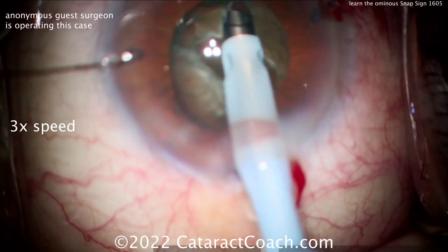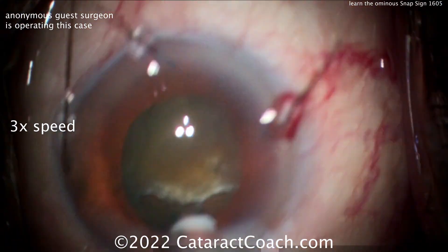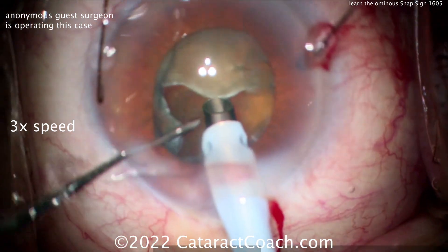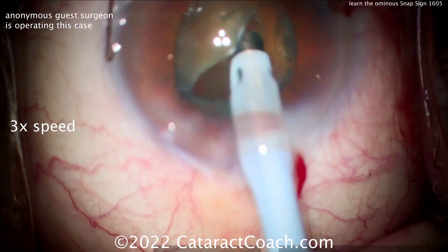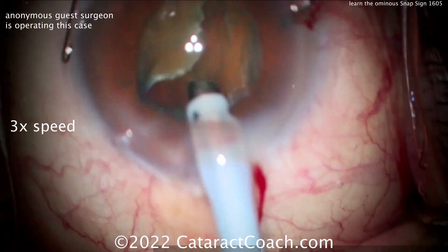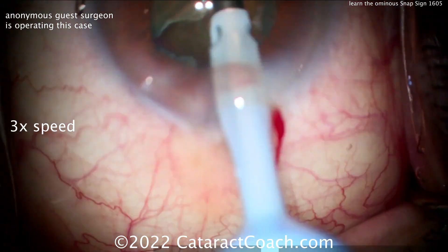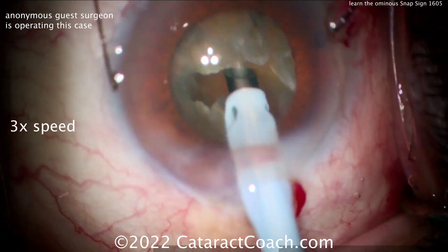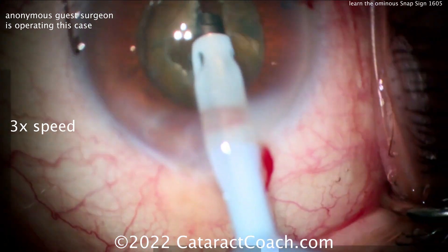There's a gap between the iris and the nucleus. Trying to groove it again — at this point, this is kind of futile. It's going to fall back into the vitreous cavity. At this point you want to bring the nucleus out of the bag and convert to MSICS — at least get the nucleus out of the bag. Some of these hints are on the subtle side and you may not realize it right away, but now you can see there's just too much movement of that whole nucleus.